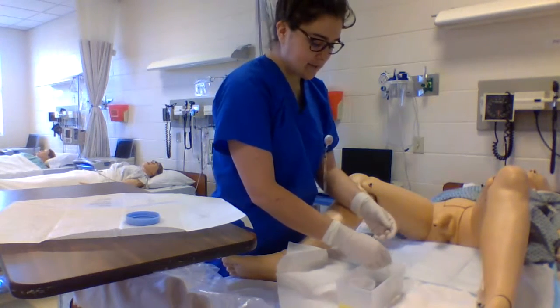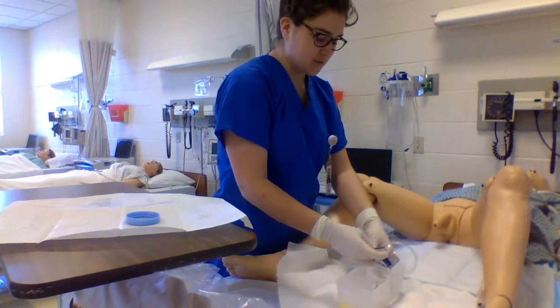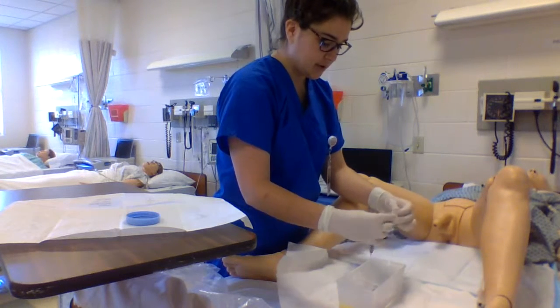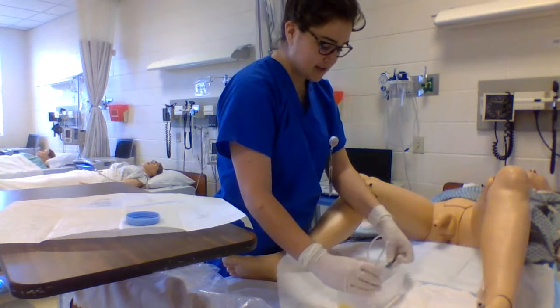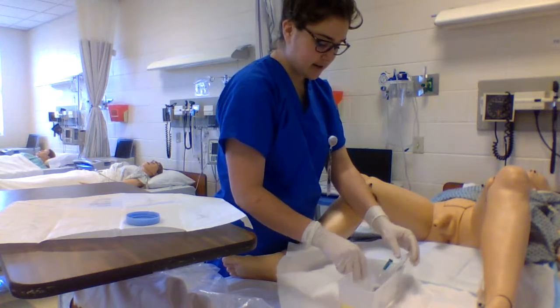I'm going to go ahead and set up my catheter. I'm going to put it in lube, and that way it's more comfortable when being inserted. I'm going to make sure that I don't fling it around everywhere, as it still needs to be sterile, and I'm not crossing my hands at any point. So, bringing that over there.